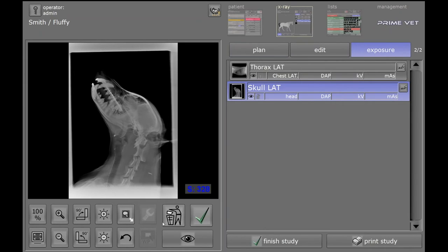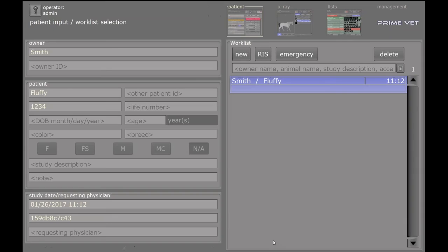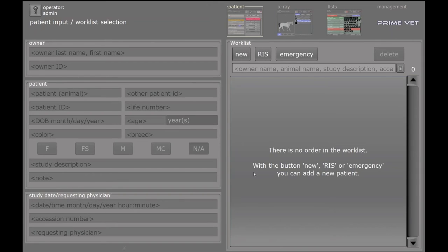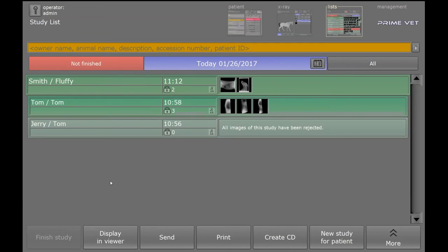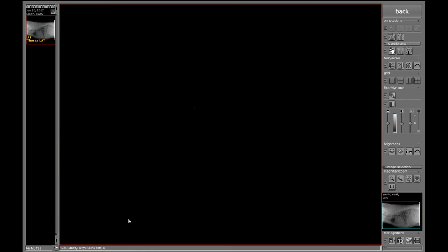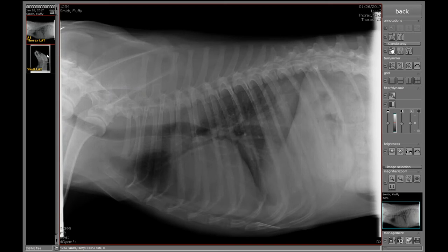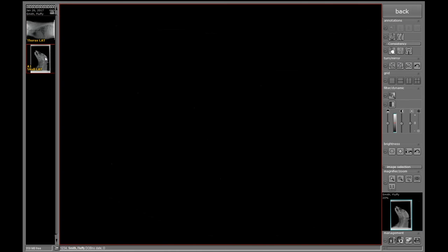When I'm finished with my exam, click Finish Study. Images will be saved. Go over to the Worklist. Find Fluffy here. We can display those in the viewer. And there's our two images.